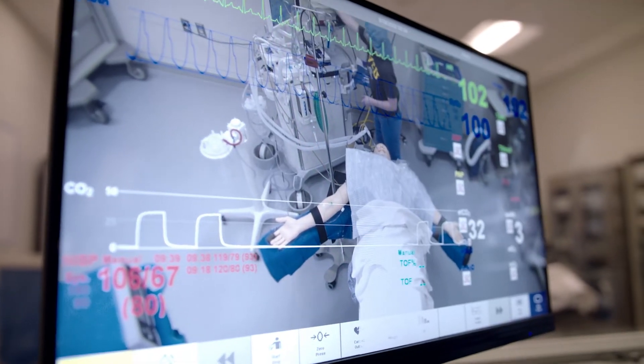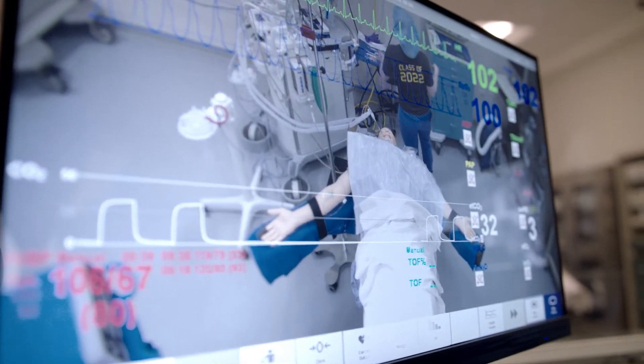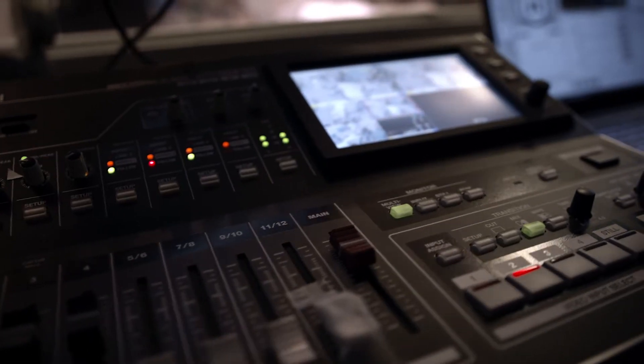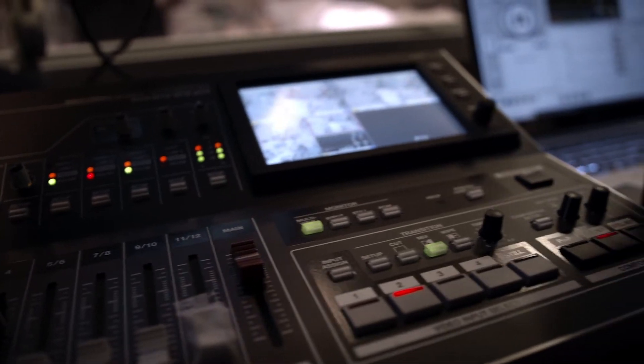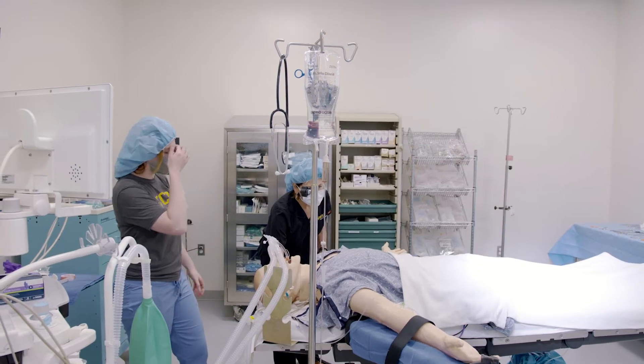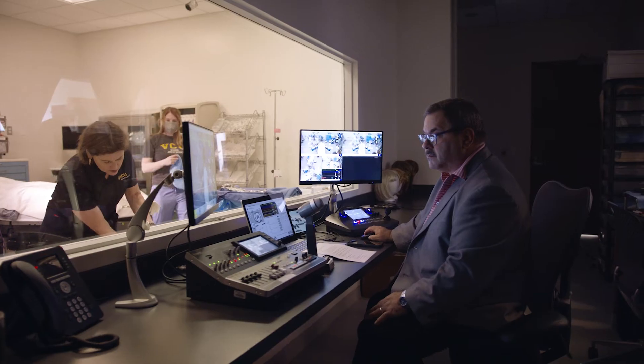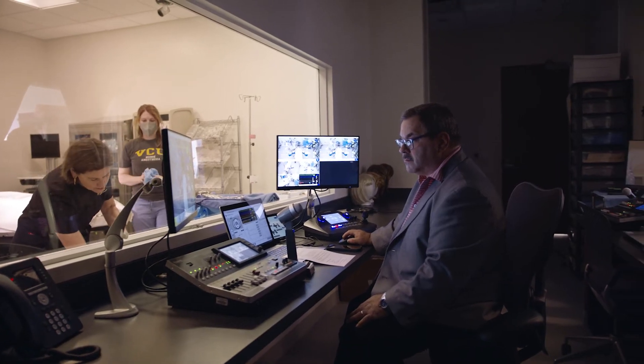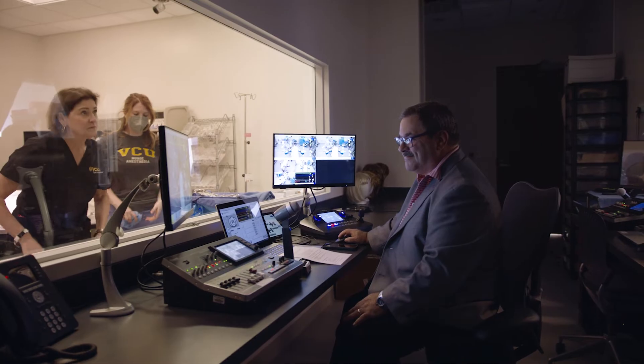The sim lab is about three thousand square feet, about three million dollars worth of equipment — real OR tables, anesthesia machines, instruments, electrocautery. Everything is real except for the patient.